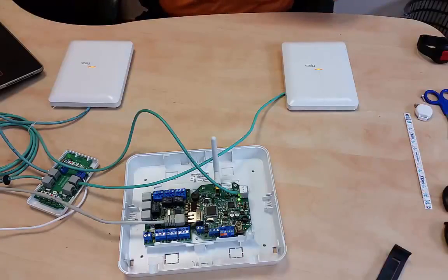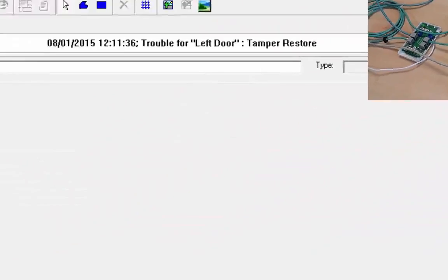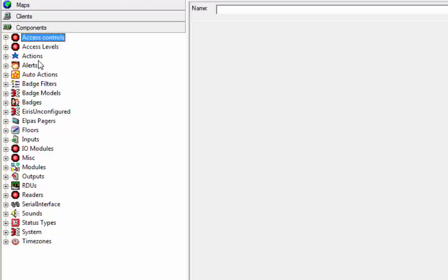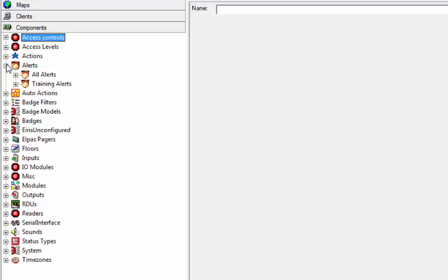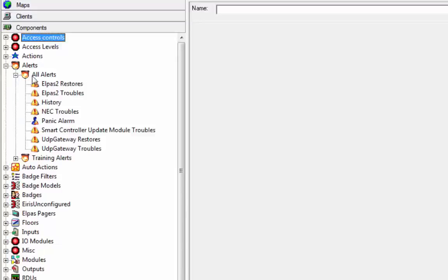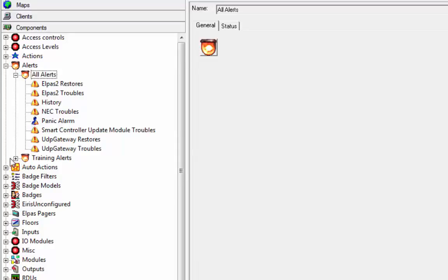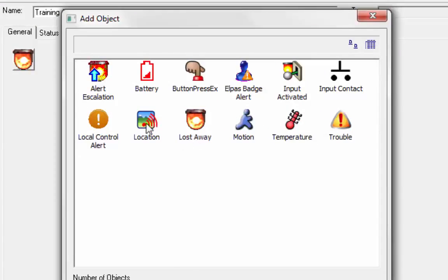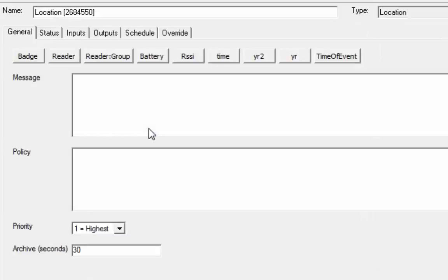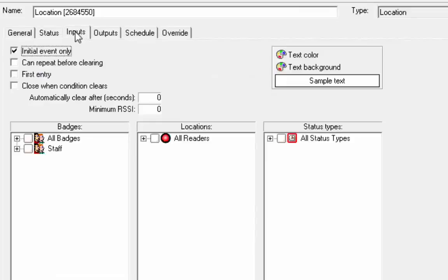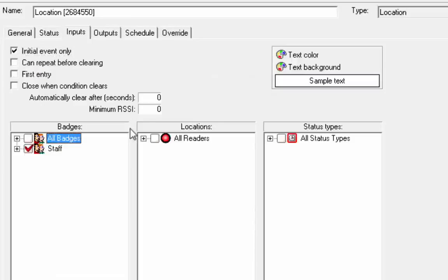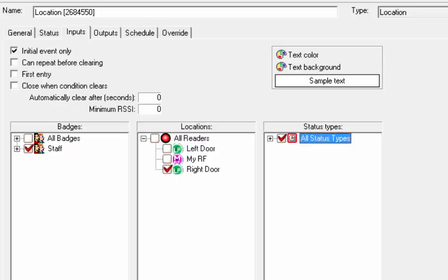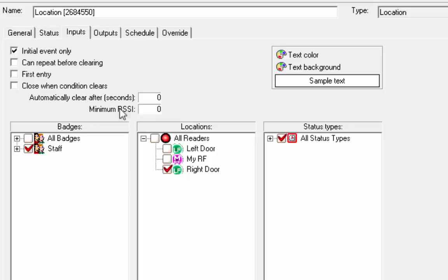Let's go into our setup and let's do an alert, a location alert that alerts when the tag is in this location, the right LF. So we're going to go into my alerts, my training alerts group. And by type, I'm going to do a location alert. We could do an LPass badge alert on the LF event, but now we want to do a location alert because I want it to clear when it leaves that location. So the input is going to be the staff badges upon entry into the right door, regardless of the status. I want to close when the condition is clear.